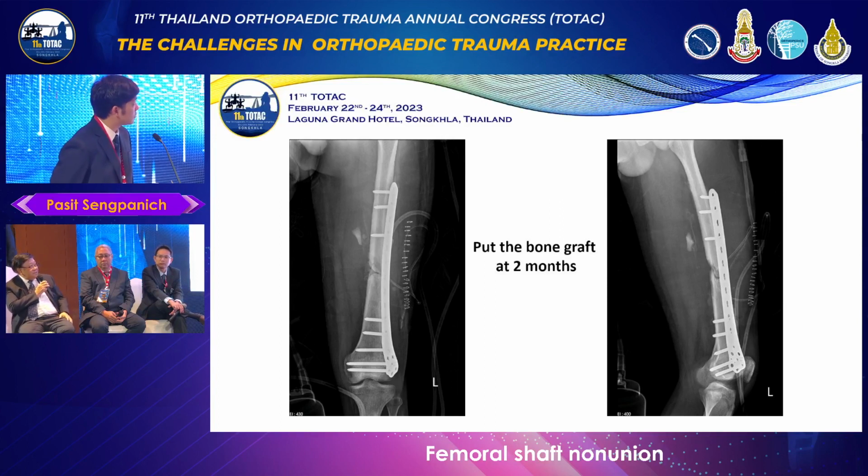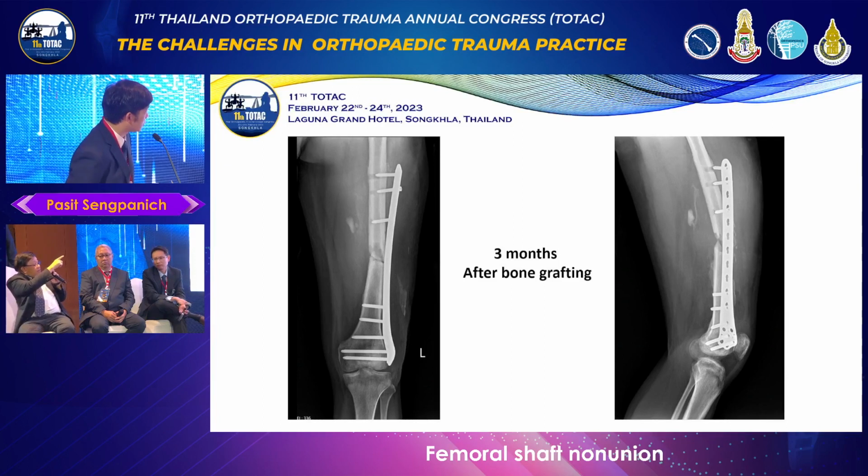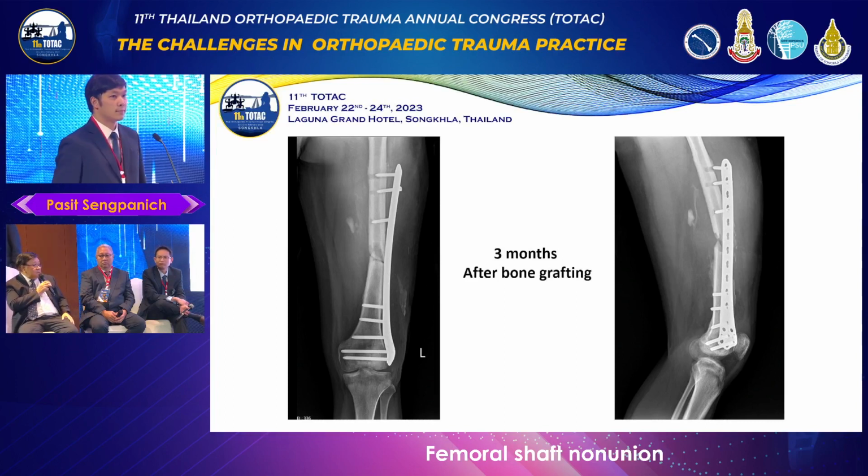Now, the problem is the screw is pulled out. What you can do, I'm not sure whether the original hole is still possible to use. If the bone is good, I may still use the same plate, but now I cannot use the locking screw. I probably have to insert a conventional screw, but in a different direction, not perpendicular. If I count, I still have 4 or 5 cortical screws that I can put in at a different angle. You cannot put the locking screw because there's already a big hole there. And of course, insert maybe more screws on the distal part, instead of changing everything, I may try that way.